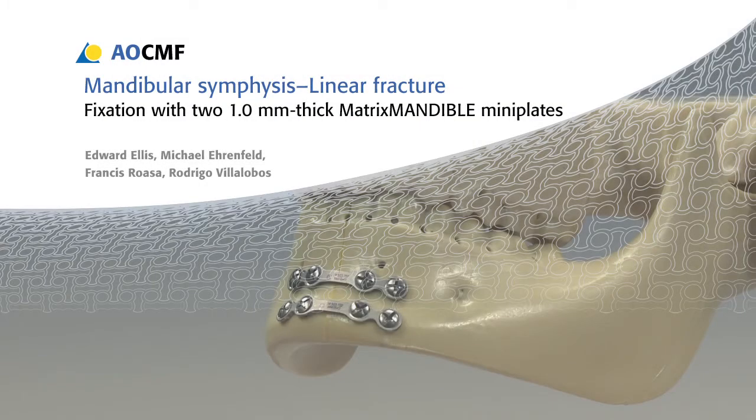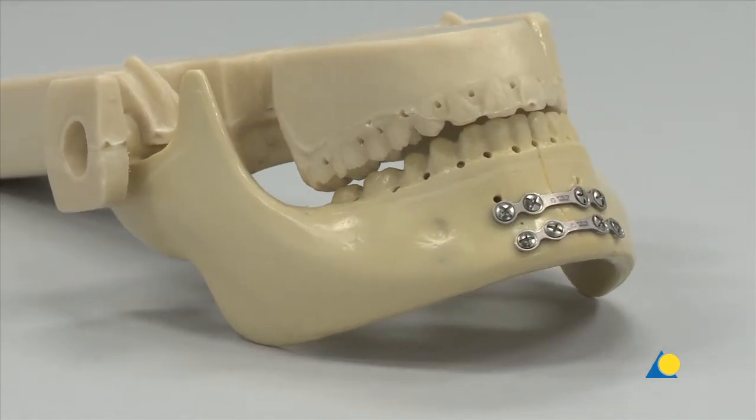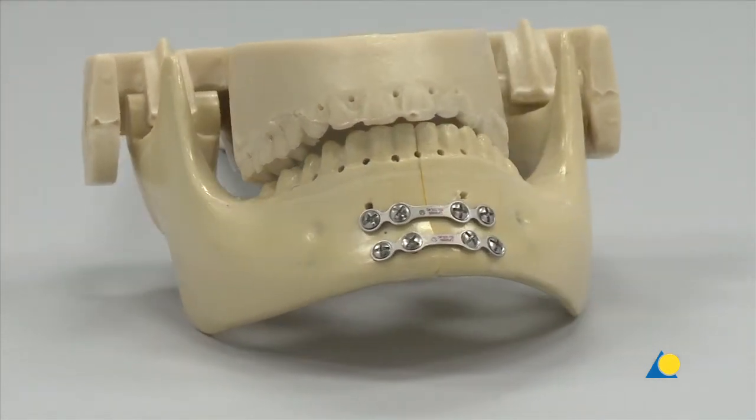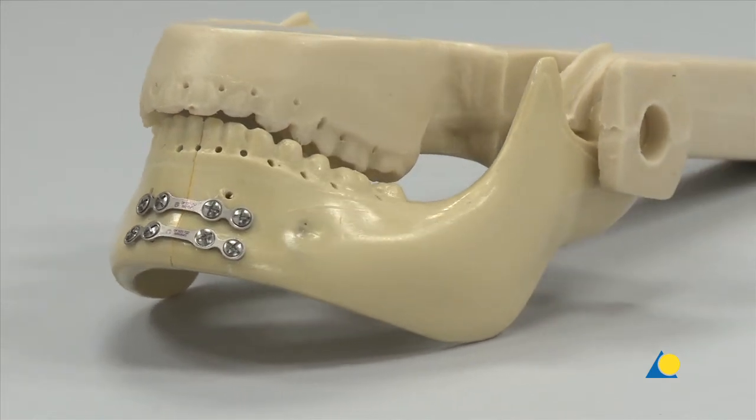This presentation will demonstrate the technique for the fixation of a linear mandibular symphysis fracture using two 1 mm thick matrix mandible mini plates. This method provides stable fixation by relying on the bony buttressing of the fracture. It is technically less demanding, but not as stable as lag screw fixation.